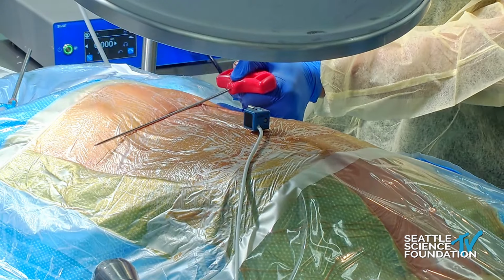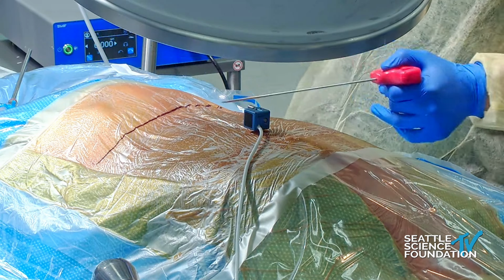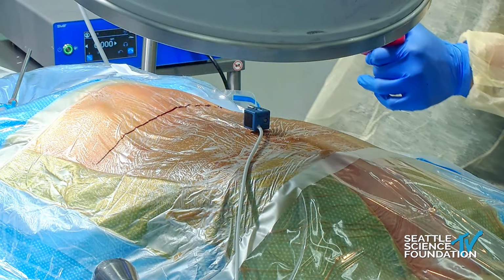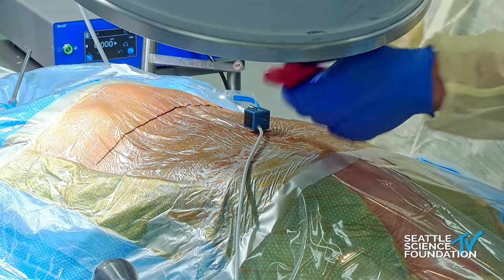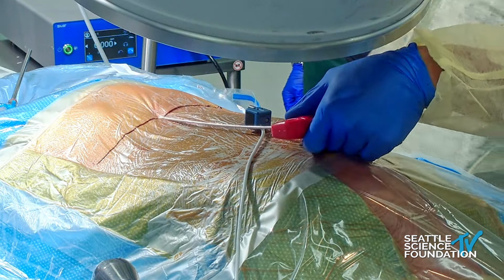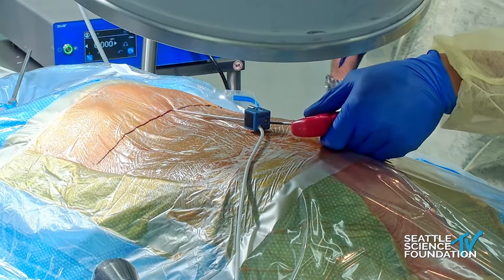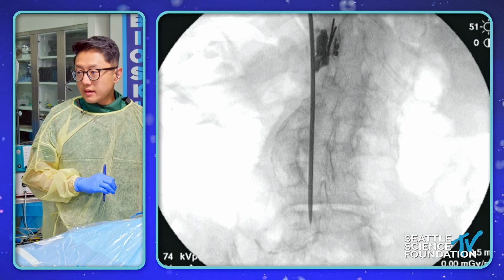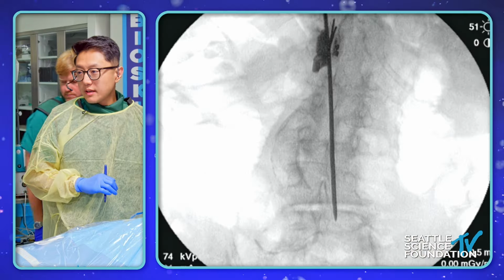So this marking, usually I use that as a reference point for the radiographer to look at the wag, how much wag should be done once we go lateral. And then I'll mark the midline as well. Let's take a shot there. Okay, one more shot there. Okay, one more there. Okay, one more there. Okay.